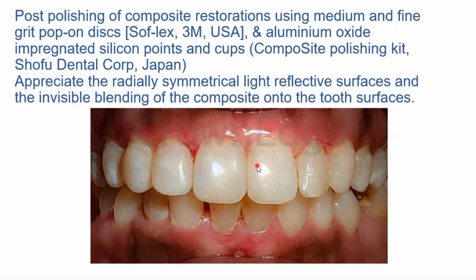Etchant has been removed for that purpose, but there's another very important purpose. That is because when we are using it in the deeper portions of dentine, our etchant is going to create post-operative sensitivity. It's as clear as that. It's as simple as that. The deeper you go in the dentine and you use your etchant, it is going to create some amount of post-operative sensitivity. So to reduce that post-operative sensitivity, etchant was incorporated into the bonding agent, so we do not over-etch.